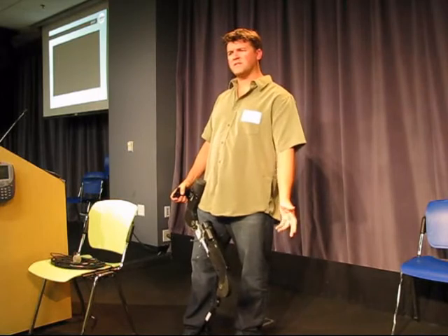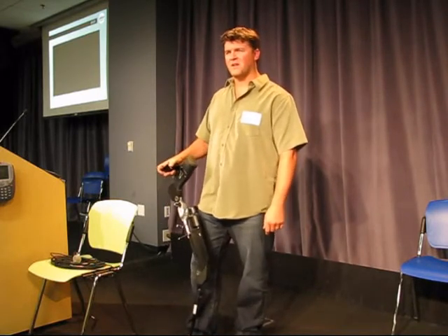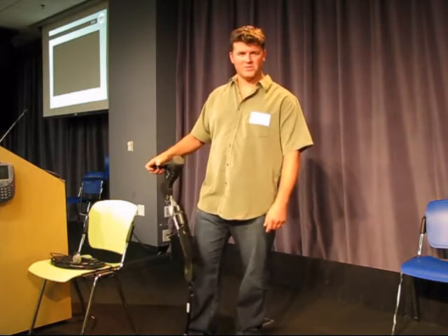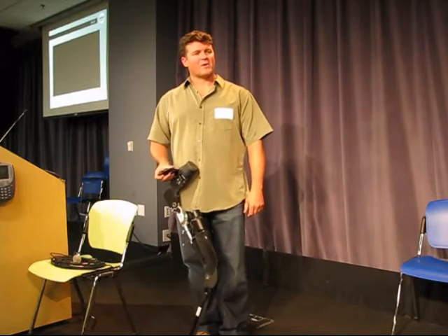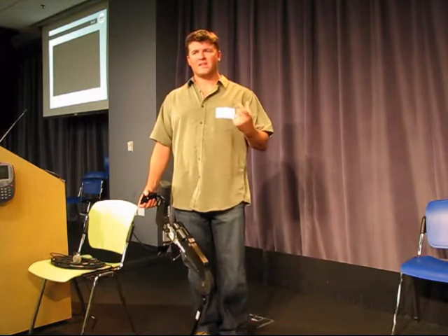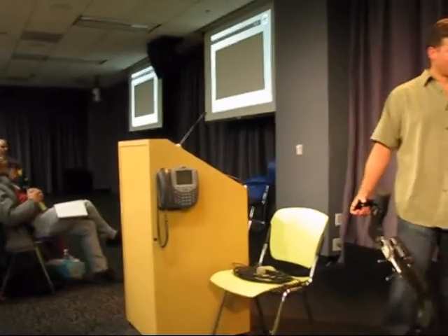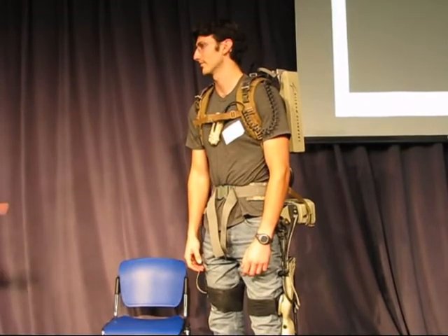We also have pressure sensors in the feet. We actually make our own sensors now for the feet. It turns out making sensors that last a long time in shoes is very difficult. We tried FSRs for a while, but they wore out. We ended up going with pressure sensors: we just filled tubes with oil and then used a simple $30 pressure sensor that measured the pressure in the tube. That was enough to last for years, actually. So this is the Hulk exoskeleton.